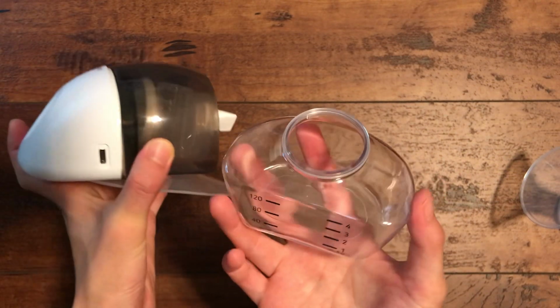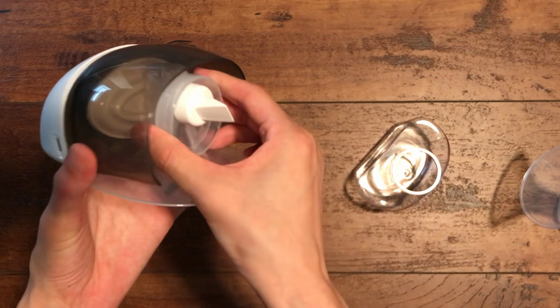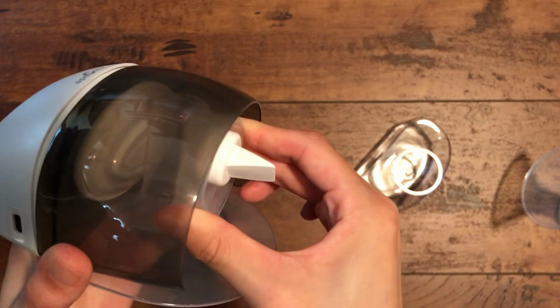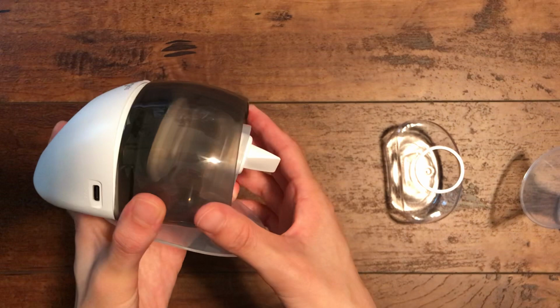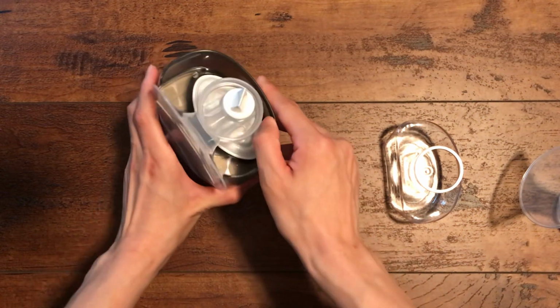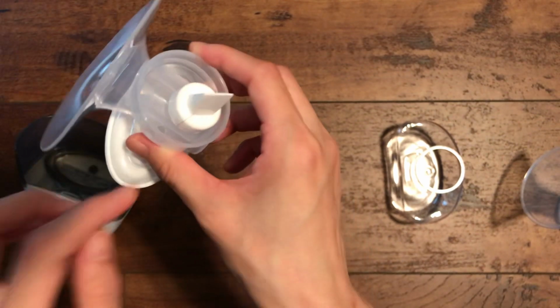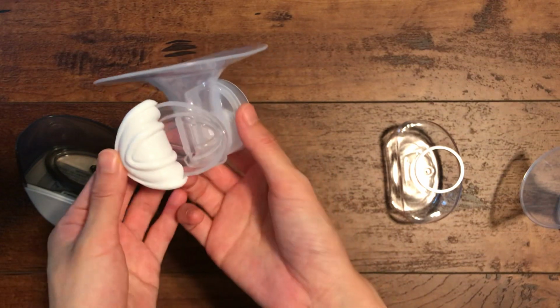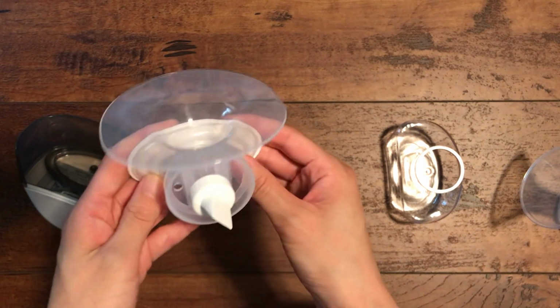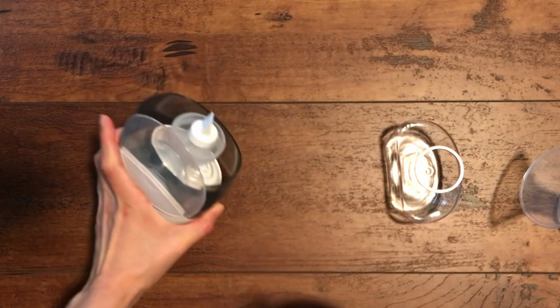Now you're kind of stuck with this heavy unit. There's not really a way to put it down because of the flange. So if you plan on using the same unit and just switching out the bottle, which you can, it's going to be tricky to put it down. Unless you have another bottle to quickly switch out, be careful, because the only way to put it down is this way, which is not advisable, because if you look at this flange part, it kind of tips. If you tip it over, the liquid will collect here. I think this is called a protector. So you'll have some milk spill over here, which might affect the suction. I think it's less of a concern with Spectra than some other brands, but still, you don't want to do that too much. So I would not recommend putting your unit down like that, because it's going to tip over.